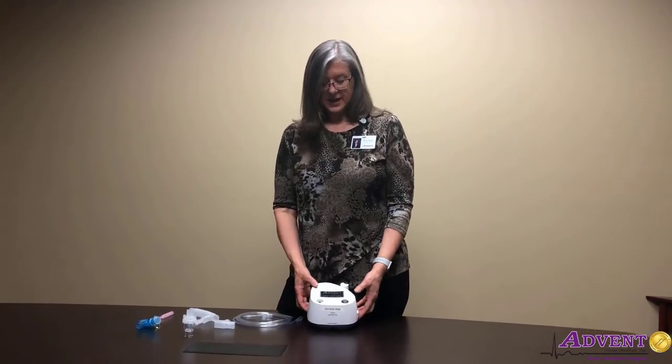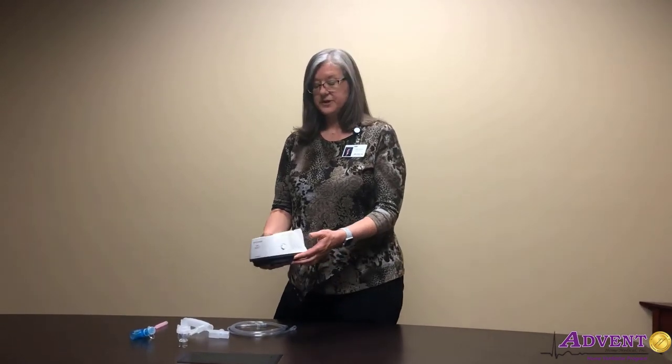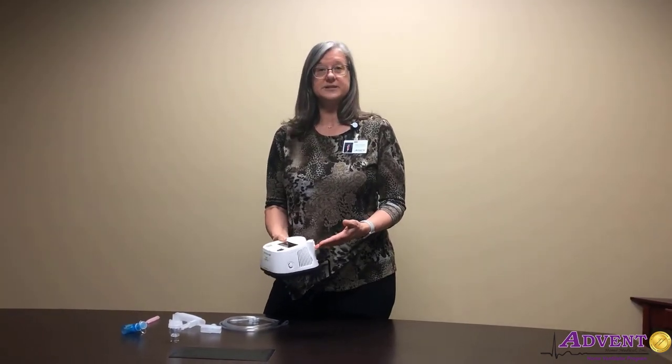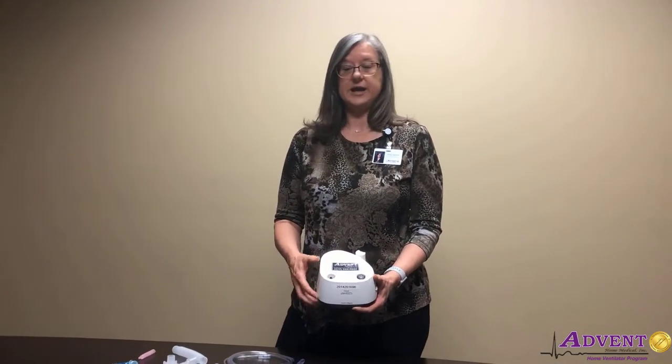I'm using today a Phillips Respironics nebulizer. Some of the features: on the back it has a nice place to set your nebulizer cup when it's not in use. We also have the inlet filter — check your inlet filter periodically. If you notice that it's discolored or wet, please replace it. Also on the top is our on and off switch and the outlet for air.